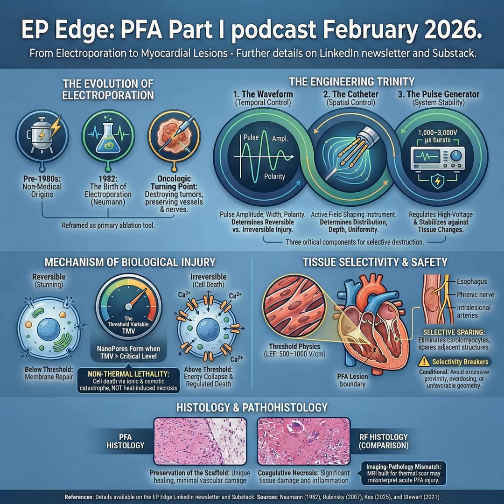That makes feedback and dosing more complex than RF, which leads to one of the most important EP concepts in PFA, the acute silence trap, because reversible electroporation and stunning can suppress electrograms. Acute loss of signals or acute non-capture does not guarantee irreversible injury. Acute silence can reflect stunning, not durable ablation. That single concept, stunning versus death, will matter again in part 2 when we talk durability.